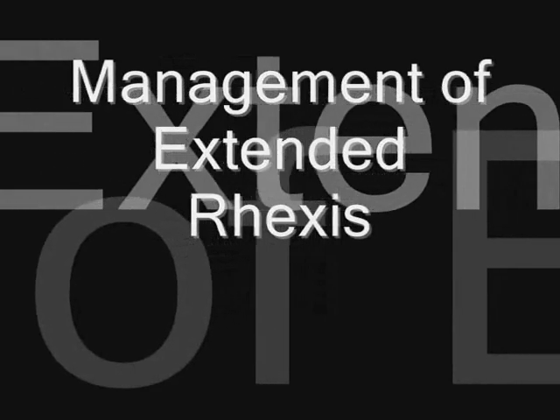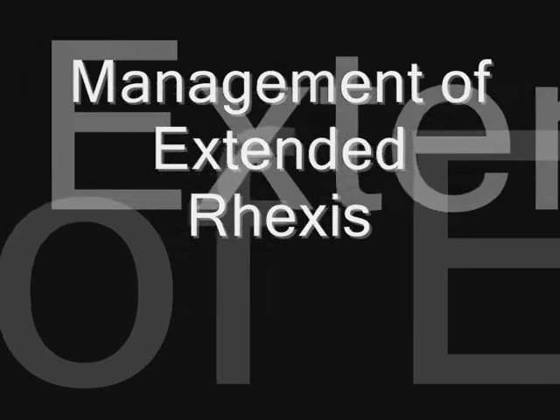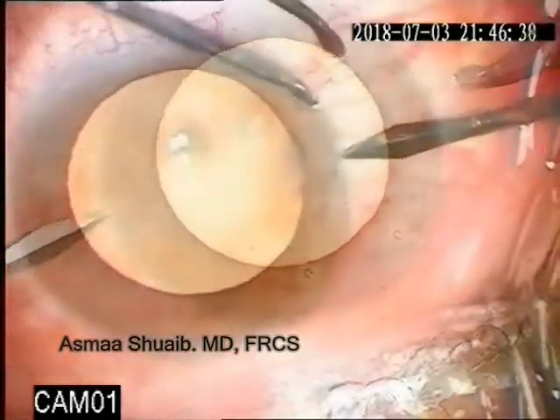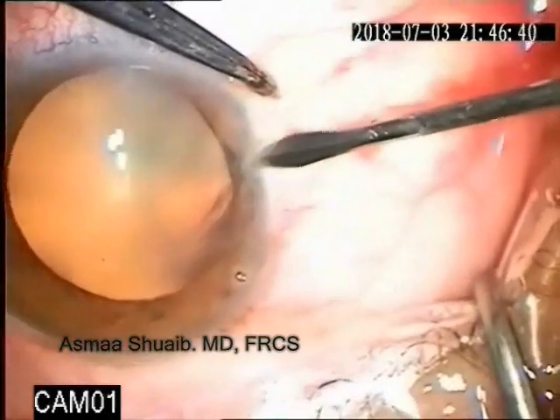Hello, in this video I am going to discuss the ways to manage a case of extended rhexis. This was a case of soft cataract — a posterior subcapsular with no nuclear element.